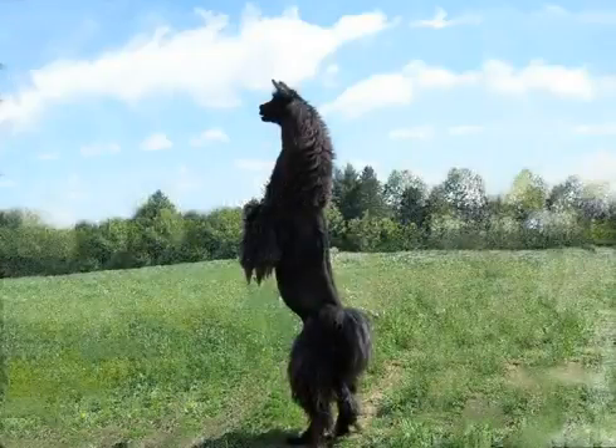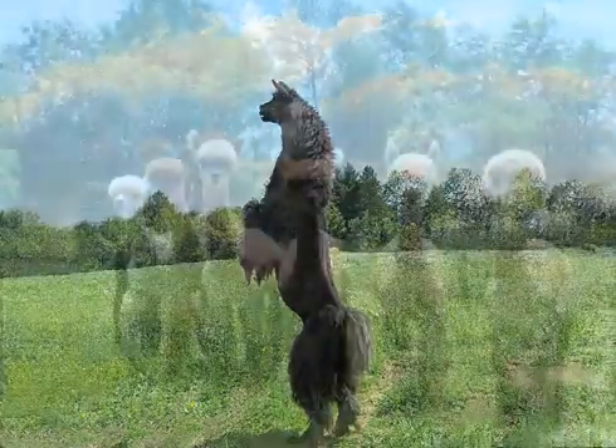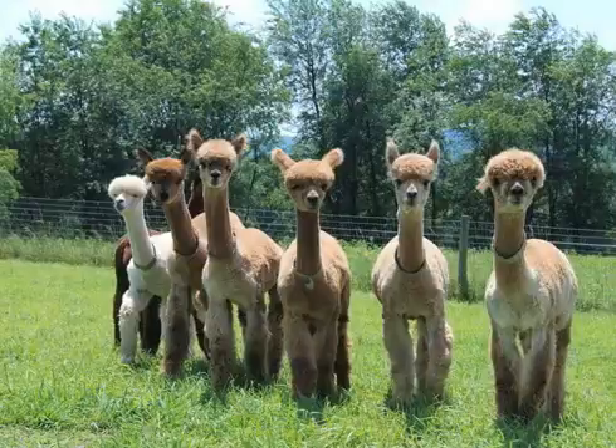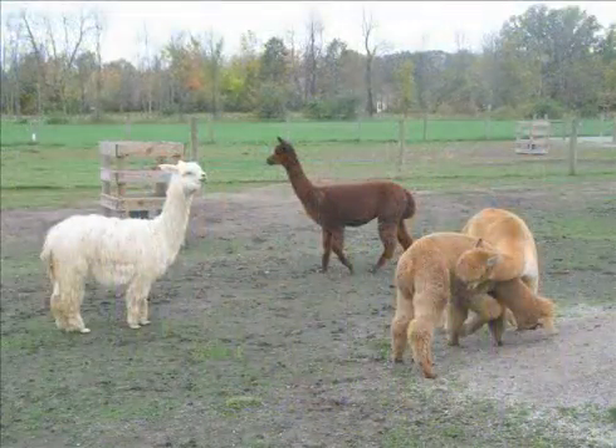This video is to demonstrate accepted routine husbandry practices in camelids. If you cannot perform these procedures safely or humanely on your own animals, or you are concerned about performing these procedures correctly and without injury to your animals or yourself, we recommend that you consult a veterinarian for assistance.